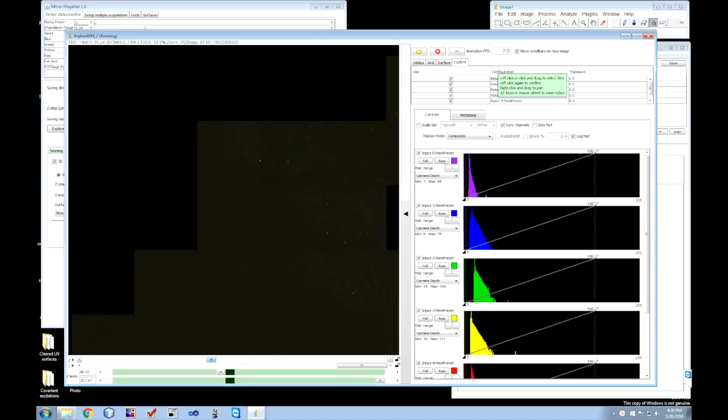We began by having explored the first 120 microns below the surface of a tumor in intravital microscopy. We conducted this exploration with a constant amount of laser excitation, and as you can see, as we go deeper, the signal falls off dramatically.